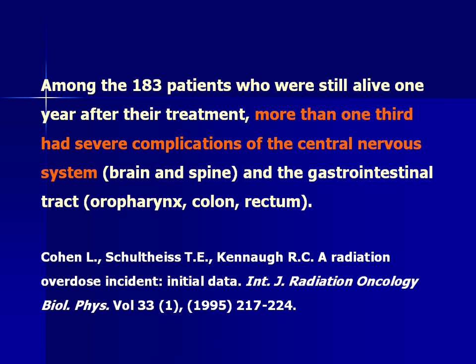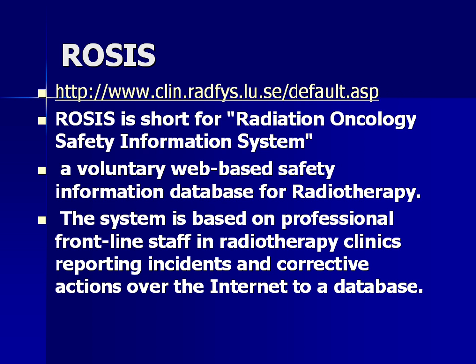Again, I think sometimes we have this mindset of being complacent and not looking for something that can go wrong. What disease site was treated? It was her brain, and I think it was her brainstem that got severely overdosed. Yes. And that's likely when there's a big problem, it'll be caught when it's spinal cord dose or GI, that type of thing.